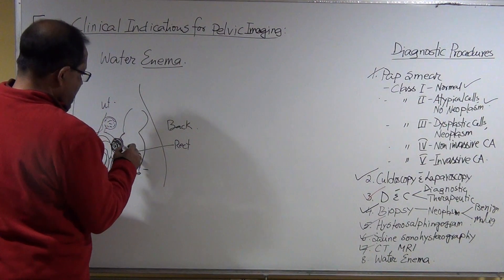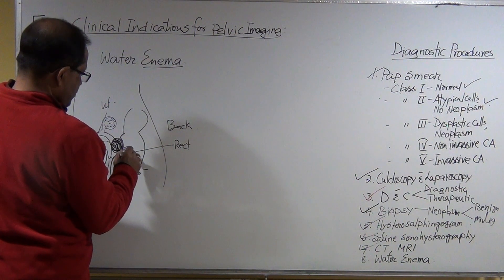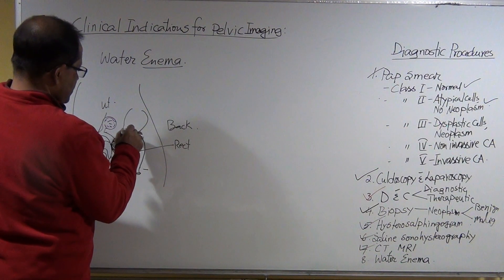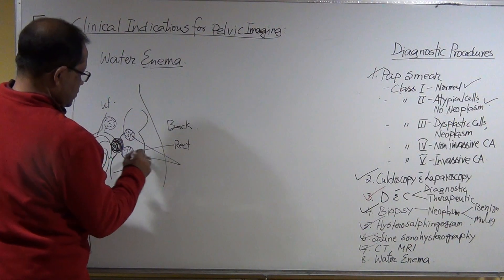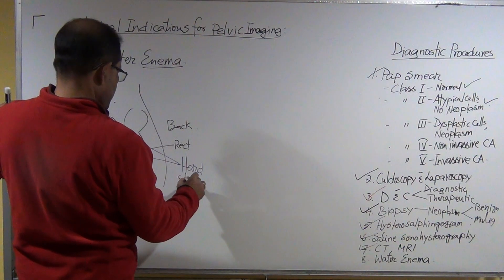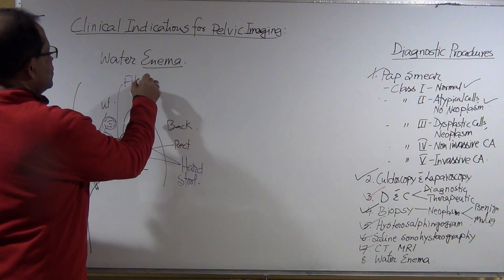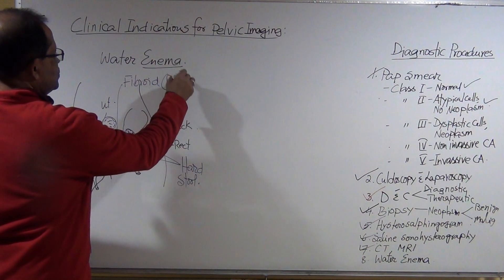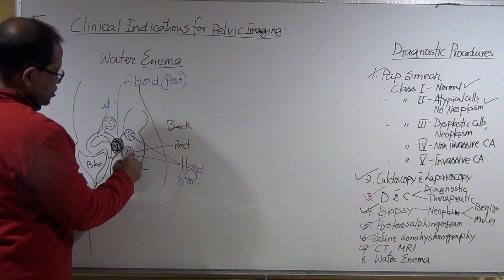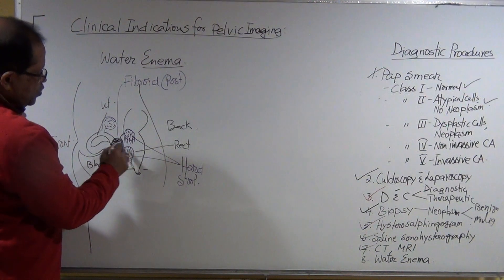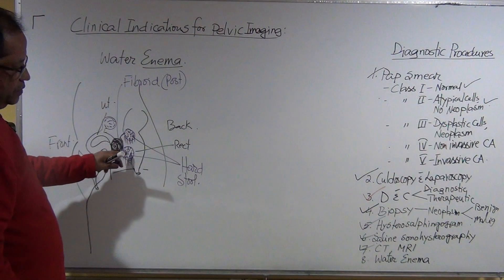The patient may also have hard stool inside the rectum, and this is a fibroid posteriorly. Sonographically, you can see both are producing shadow and both look heterogeneous and complex. So how can you rule out that this mass is not a fibroid?